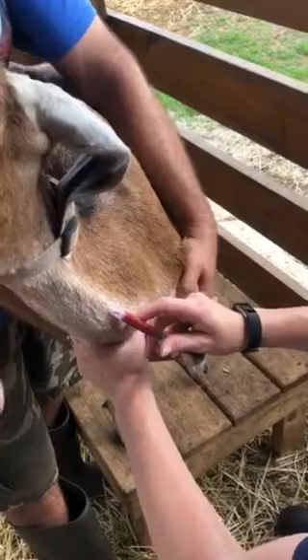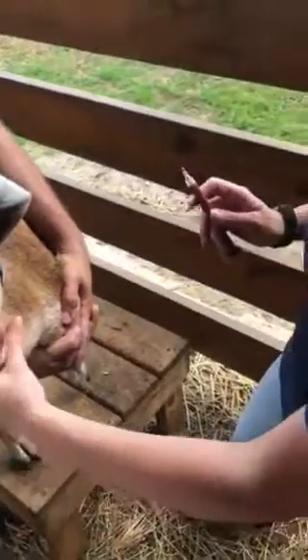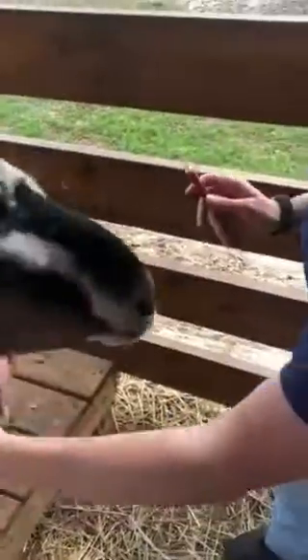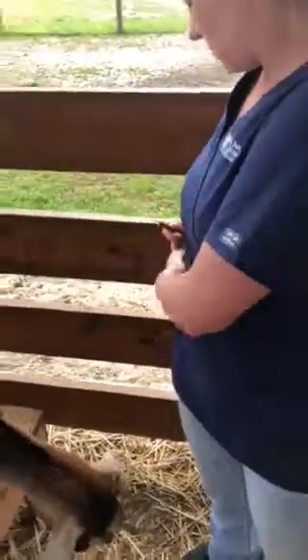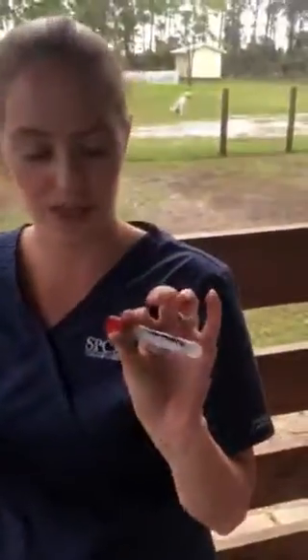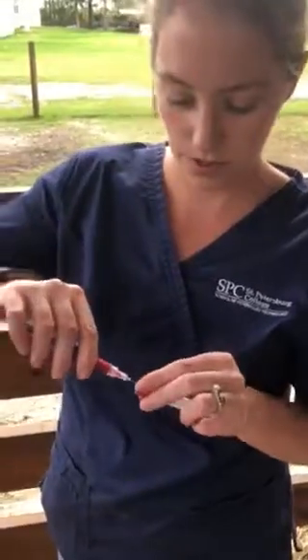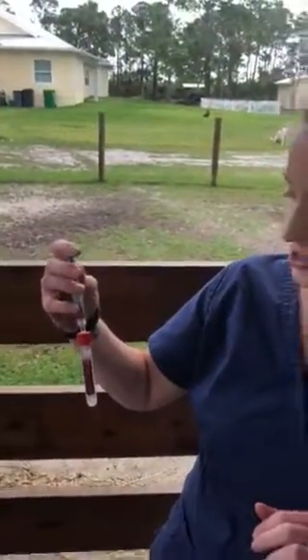And we're collecting a blood specimen for a chemistry panel. So withdrew the syringe and just making sure no hematomas form. And I have our blood collection tube — it's already pre-labeled with her name. And putting our blood specimen into the tube.